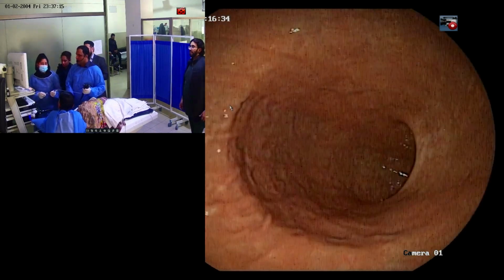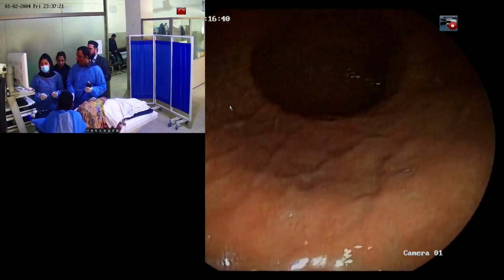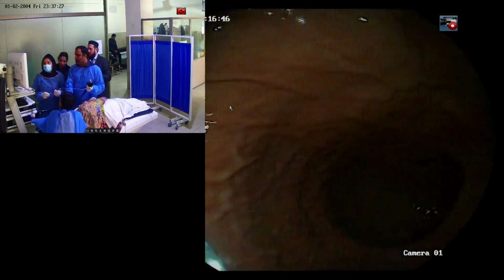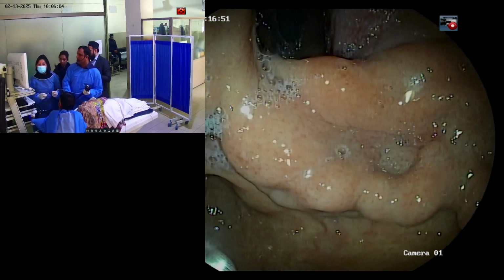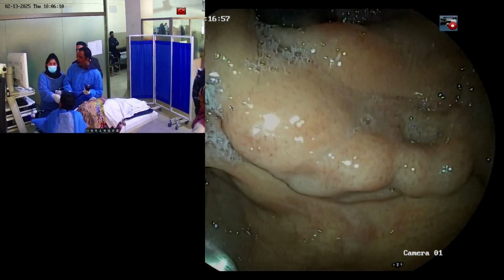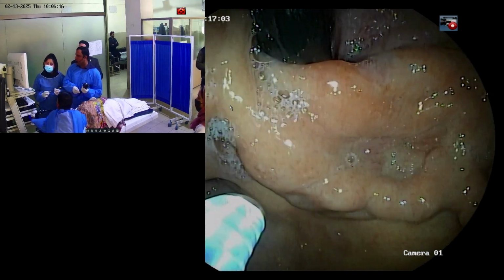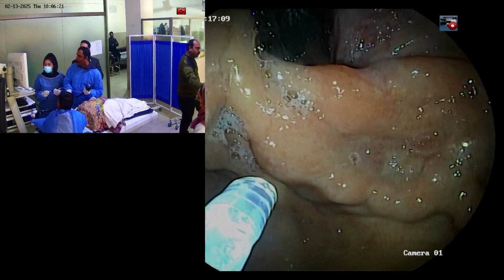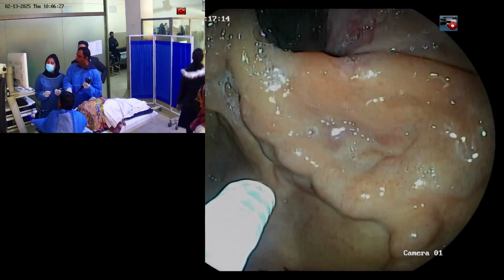Okay. So all the instrumentation should be done with a straight scope. So the scope is now straight. Our needle is out, and then we move to the varix, toward the fundus. Hold it here. So if the patient is already injected, it's always better to palpate the varix and see the trajectory of the needle, where it's going. So I will be injecting into the feeder vessel.